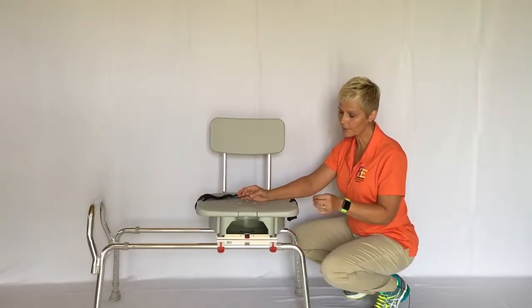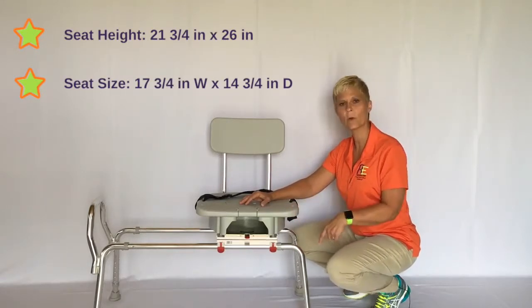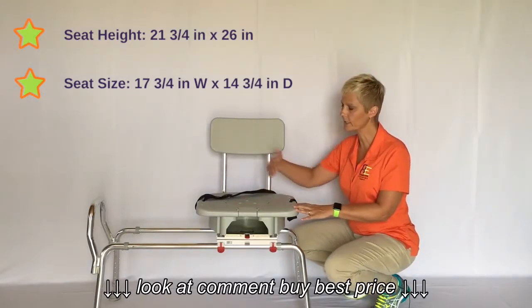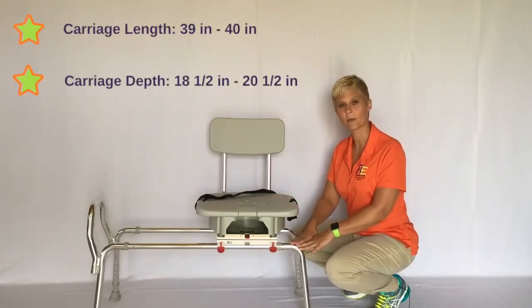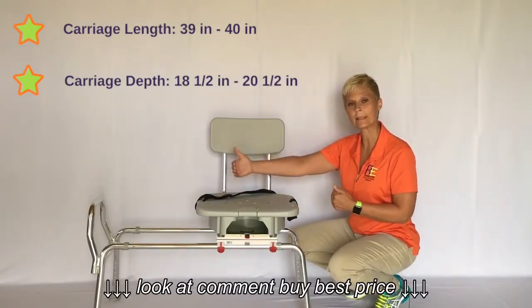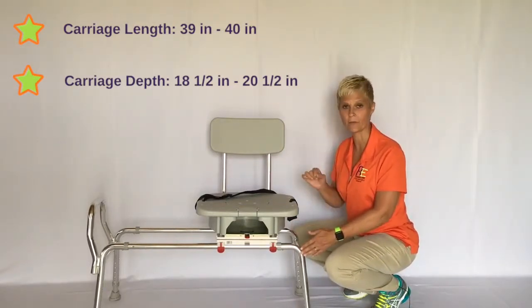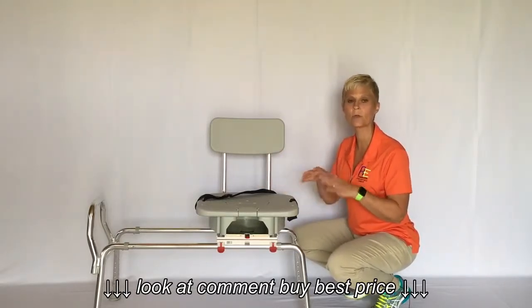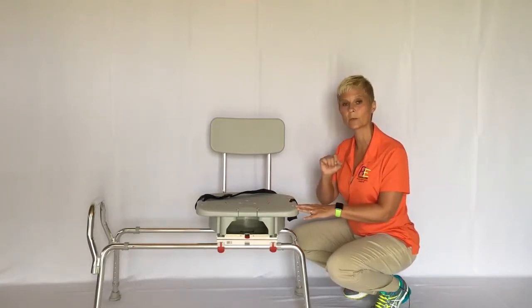A few specifications on this transfer bench: the weight limit is 400 pounds. The seat height is adjustable from 21¾ inches up to 26 inches. The seat size is 17¾ wide by 14¾ in depth. The carriage varies from 39 to 40 inches in length and 18.5 to 20.5 inches in depth. Check their site for all measurements. Because this is a hygiene product, it is non-returnable, so please take good measurements.